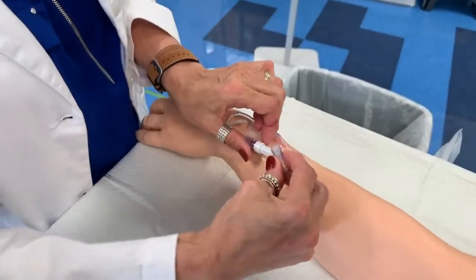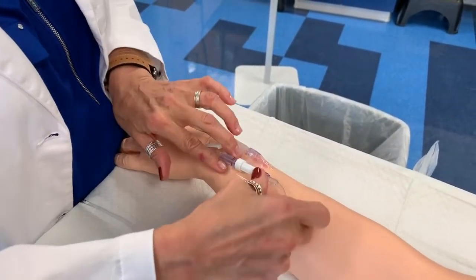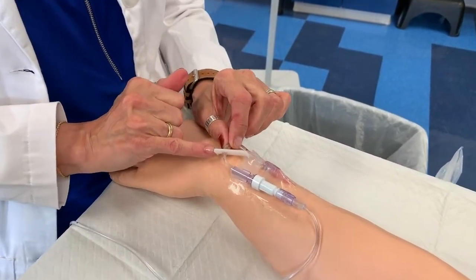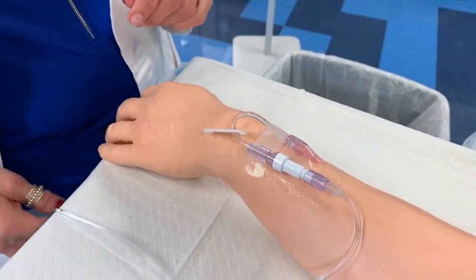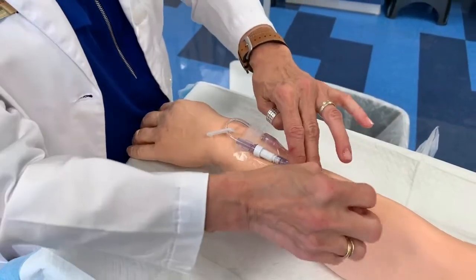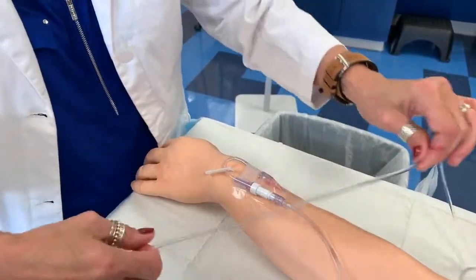So now we take our tubing and we go ahead and attach it to the Luer lock, so you kind of want to push in and twist. Now, all saline locks should have the lock closed if they're not being in use, so we want to make sure we go ahead and open that. And then I always like to use a piece of tape to secure this, and so I'll make sure I come back and do that at a later time.